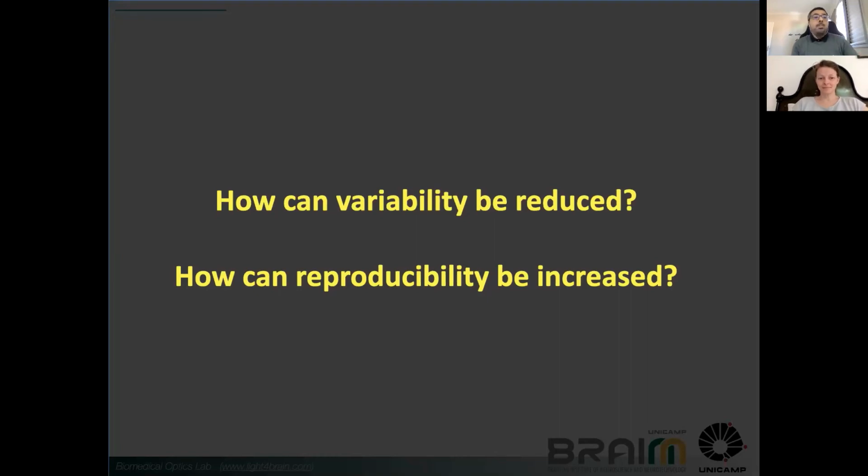As for the NIRS setup, we didn't test instrumentation, right? We were always using the same instrument and always doing the same protocol. We are always turning the system on and off, so there are no stability effects due to this instrument. But we do have something related to the NIRS setup, which is the probe positioning. How you set up your probe on the subject's head can make a difference and contribute to the variability. And I'll probably show this in about 5 minutes or so.